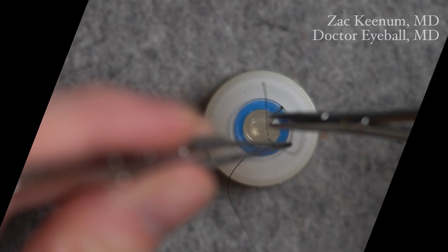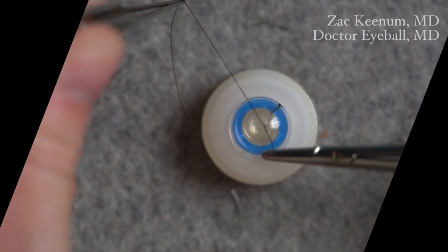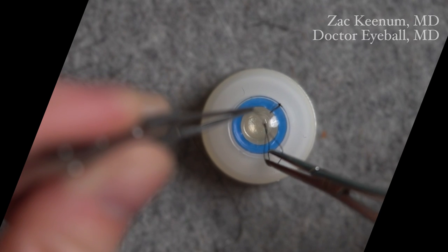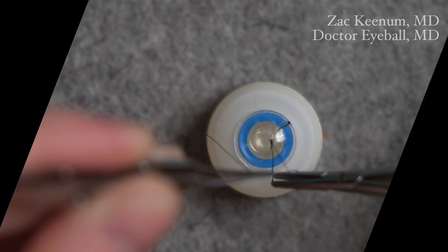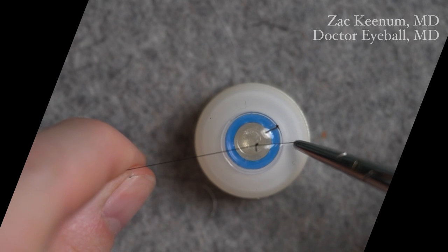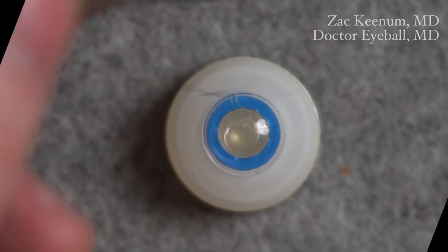This is Dr. Zach Keenum with Dr. EyeballMD. Today I'm demonstrating the slip knot technique that you can use for open globe repair and corneal laceration repair. It's a great technique because it's a 1-1-1 knot, which makes a smaller knot that's easier to bury. The biggest benefit is that it's an adjustable knot, so you can tighten and loosen it as you go, allowing you to adjust the tightness as needed during surgery.